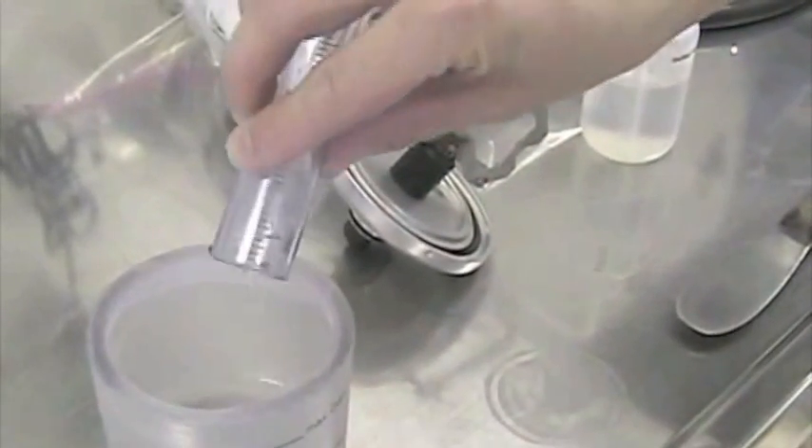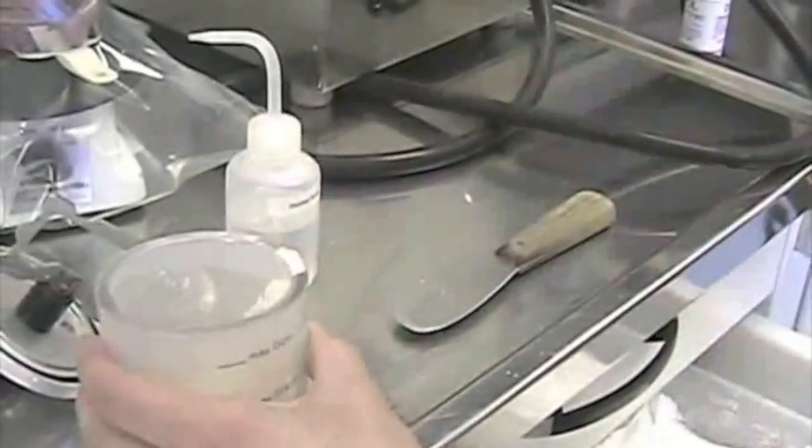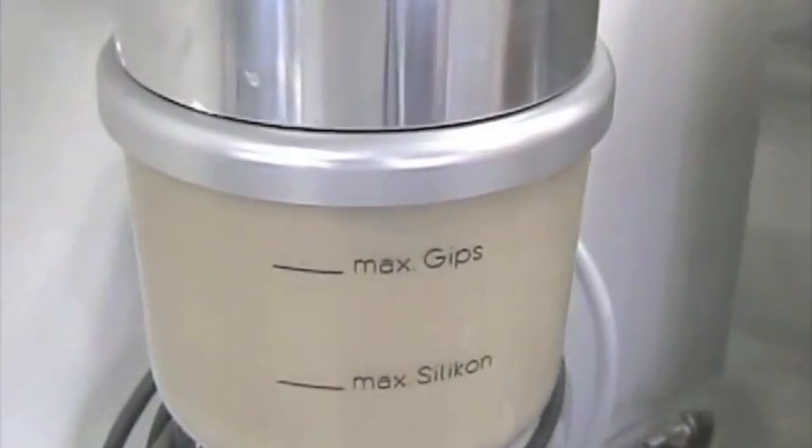So I put the water first. In any mix — like investment or stone — we always need to put the water first. And then I'm going to add three cups of stone, two and one more. We pre-mix it by hand, and then obviously we're going to use the vacuum mixer. That's a nice consistency and it's supposed to be thick — it will be a little smoother and more liquid after the minute under the vacuum. We clean the top; we want a perfect seal, perfect vacuum. And we mix it for one minute or a little longer if you want.